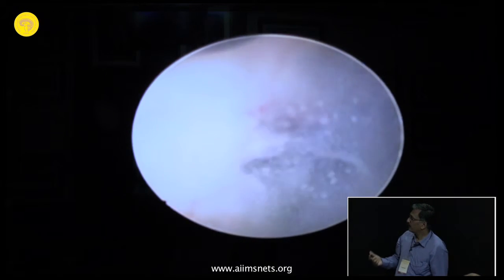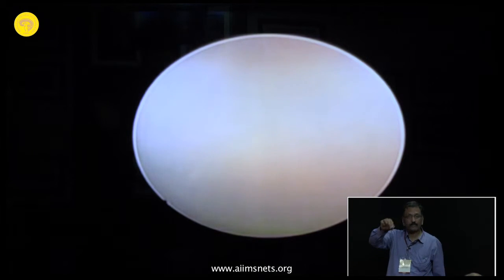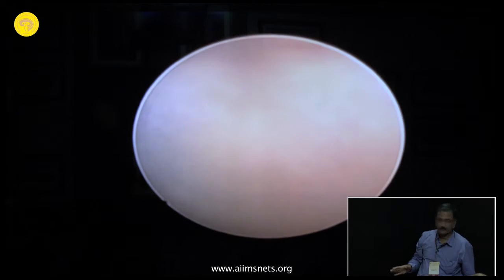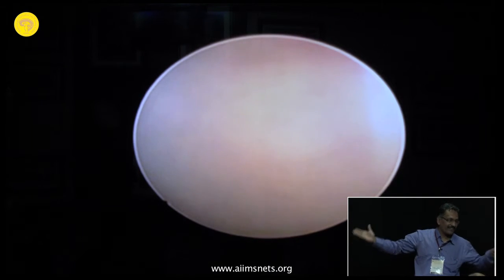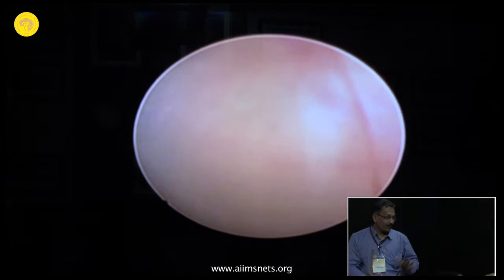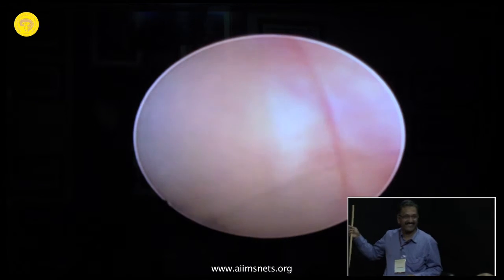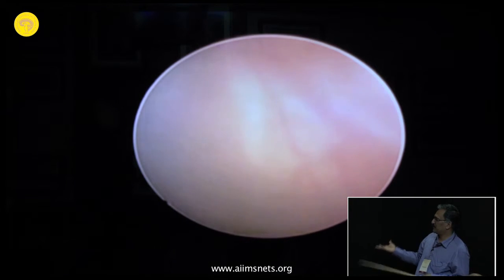And that's where you really need to feel the dorsum sellae. Sometimes with that, you can get a very vague idea. It's not necessary, but you get a vague idea. So this is not a classical endoscopy, but this is a true life situation. Videos look good, but this is what actually happens. So now you get this thing where you don't know where you are.